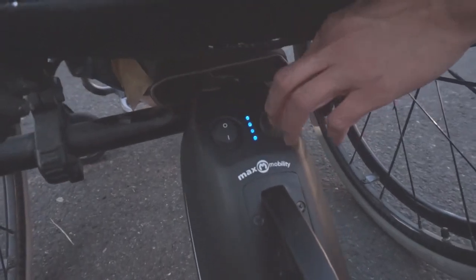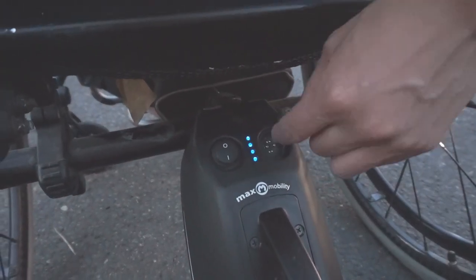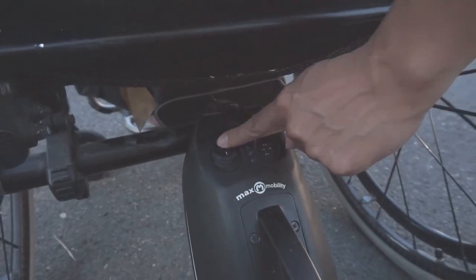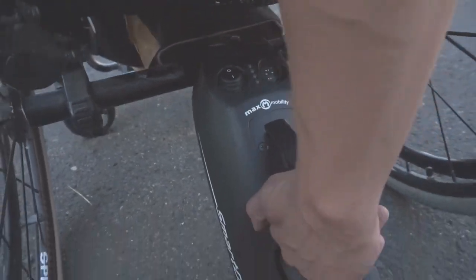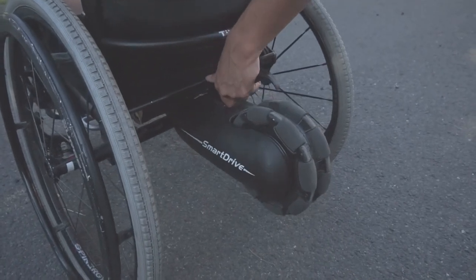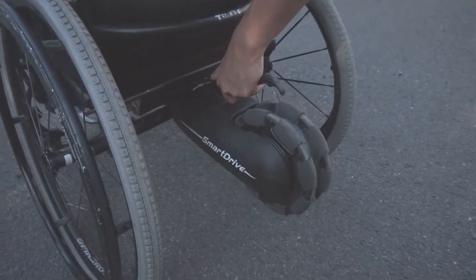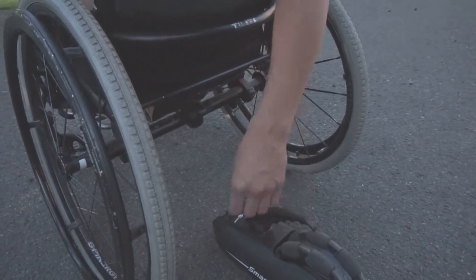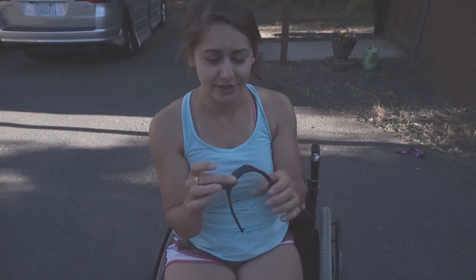This is where it plugs in to charge — it doesn't stay shut. Then that will turn it off, and then I pick it up. This is the hardest part, but you just kind of have to wiggle it and then it will come off.